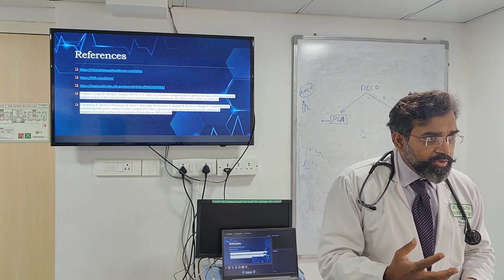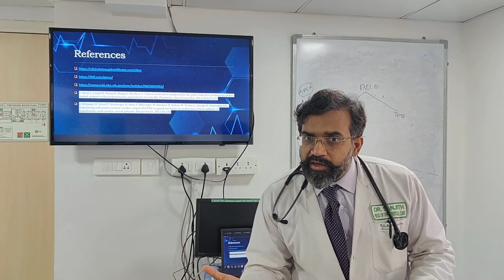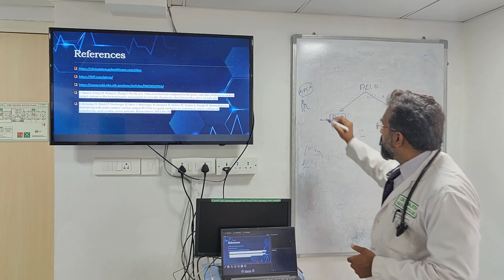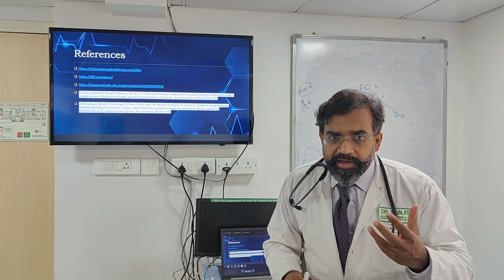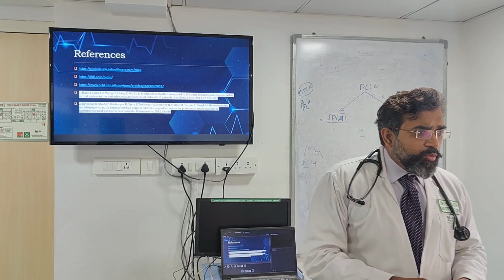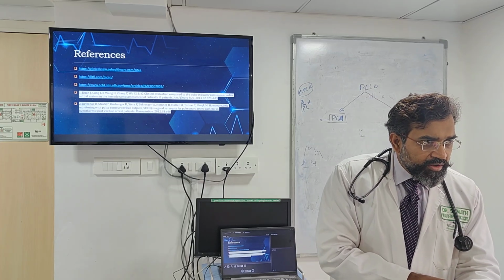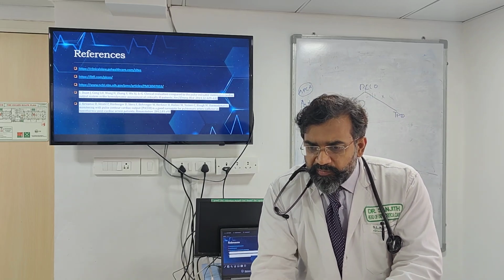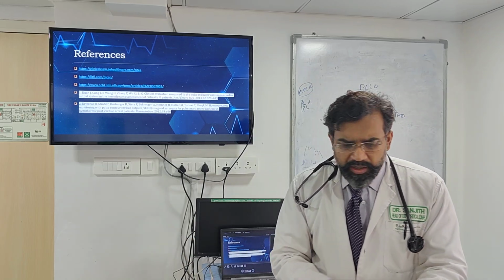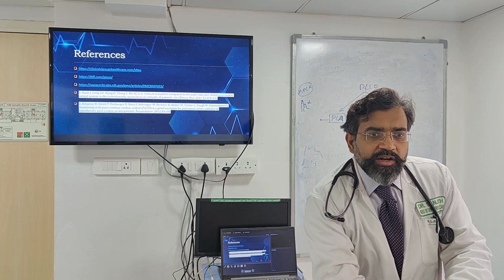It is determining your stroke volume. However, how is it getting cardiac output from that area under the curve? It is multiplying this with the demographic characteristics of the patient: what is the height, what is the weight? Because what is in the aorta is different from what is in the artery. You understand? The artery is very peripherally located. It has a reflectance that is coming. She said reflectance means what? The arterial BP is going in, and then it touches the periphery and reflects a wave.